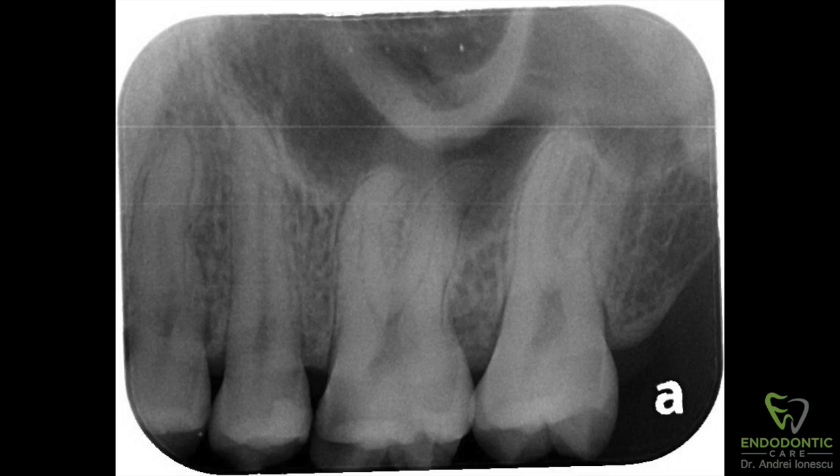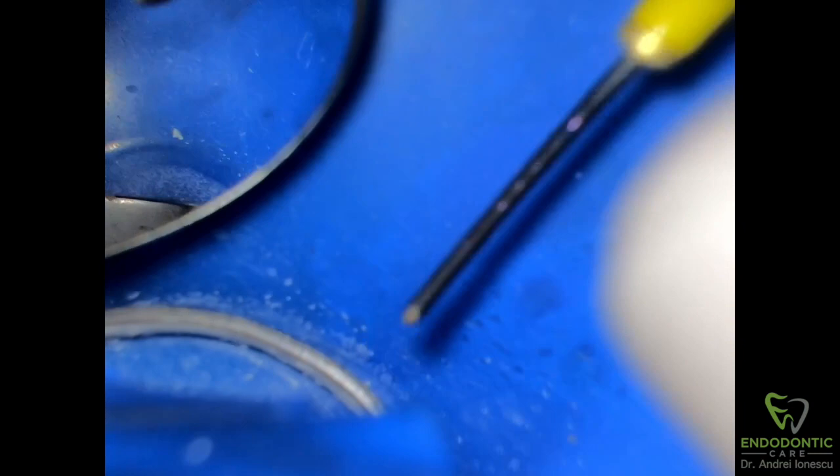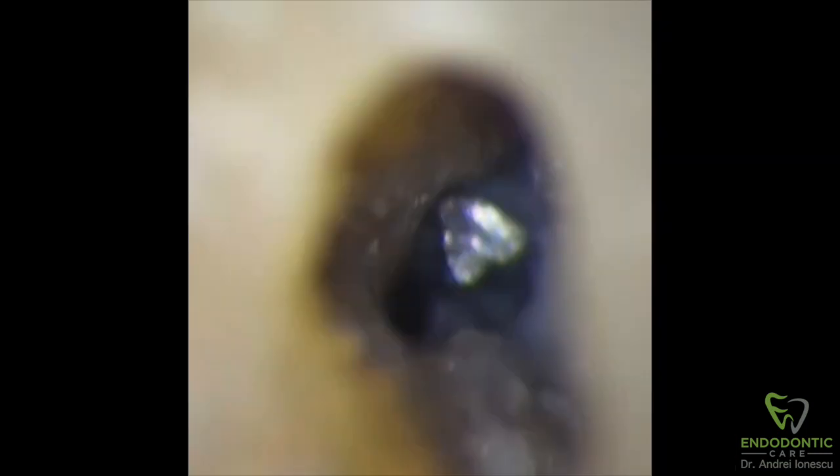This is a pretty interesting maxillary first molar, tooth number 26, with double curvature on the distal buccal root. I was aware of this curvature going in — I could see it on the pre-op x-ray — so I took all the precautions. I used hand files to create a smooth glide path, I used glide path files, but my 20.04 rotary file unfortunately separated right at the level of the CEJ.